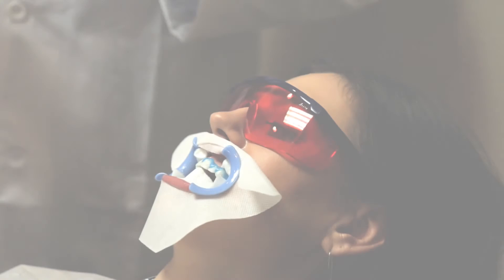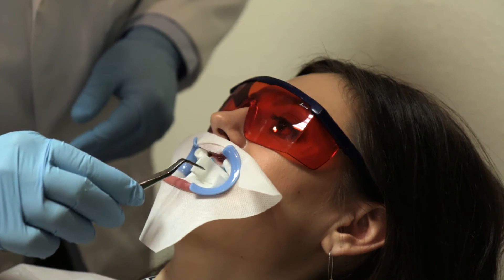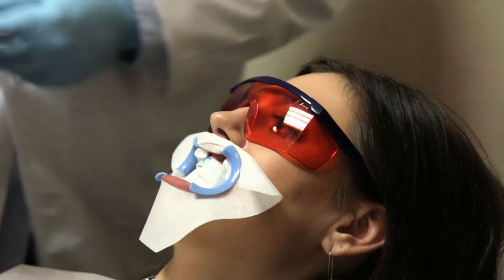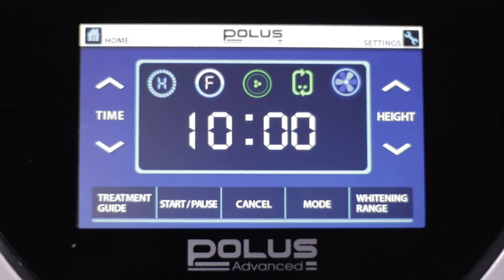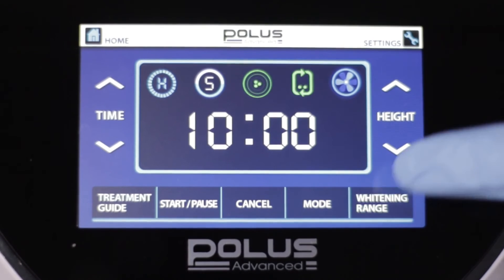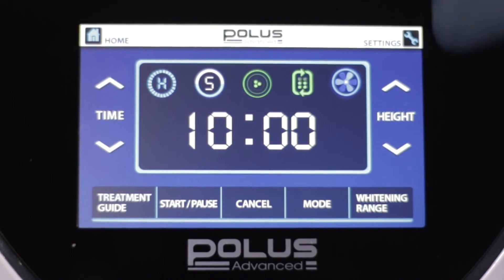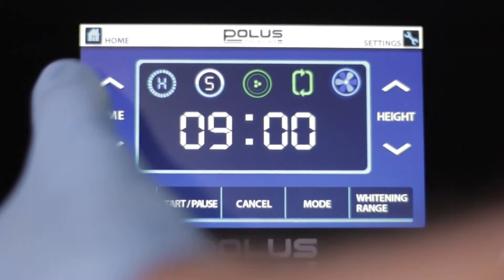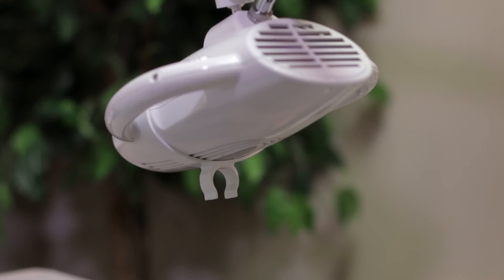Apply damp gauze to the surrounding teeth that are not being whitened in order to keep the tooth enamel hydrated during the treatment. Press whitening range on the Polis Advanced display screen and choose the single whitening option on the TUI panel. Adjust the treatment time to the desired number of minutes; the recommended treatment time for most cases is 10 to 12 minutes.